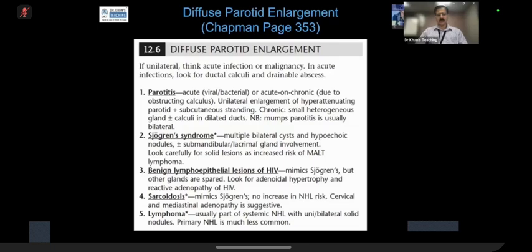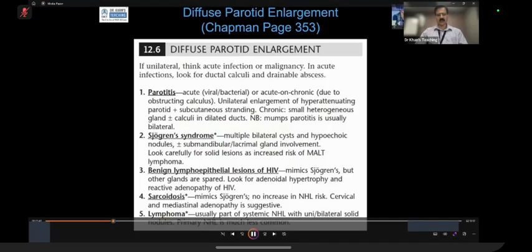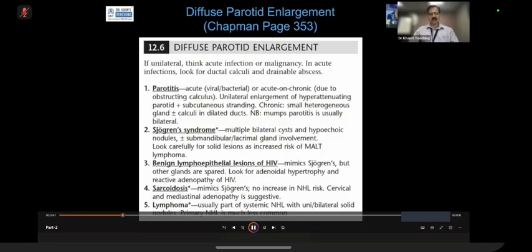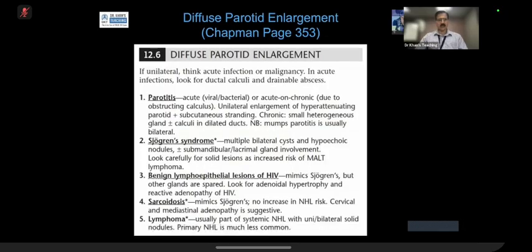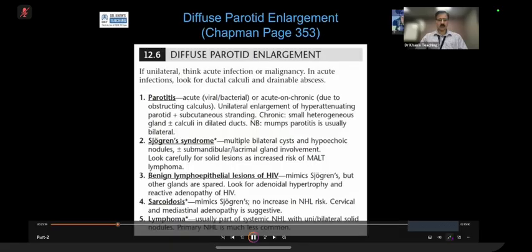This is extremely important, in your long cases, in your VIVA cases, etc. These things are critical, which are asked for, particularly in long cases. They might give you this MRI, and with that, something in the hands. And the conclusion or the unifying diagnosis will be that this is RA, which is causing Sjogren's syndrome.